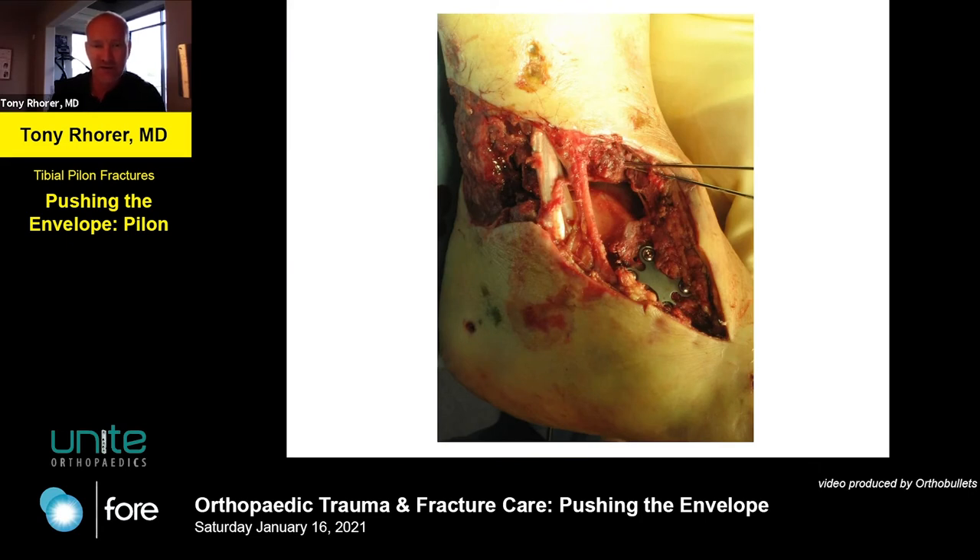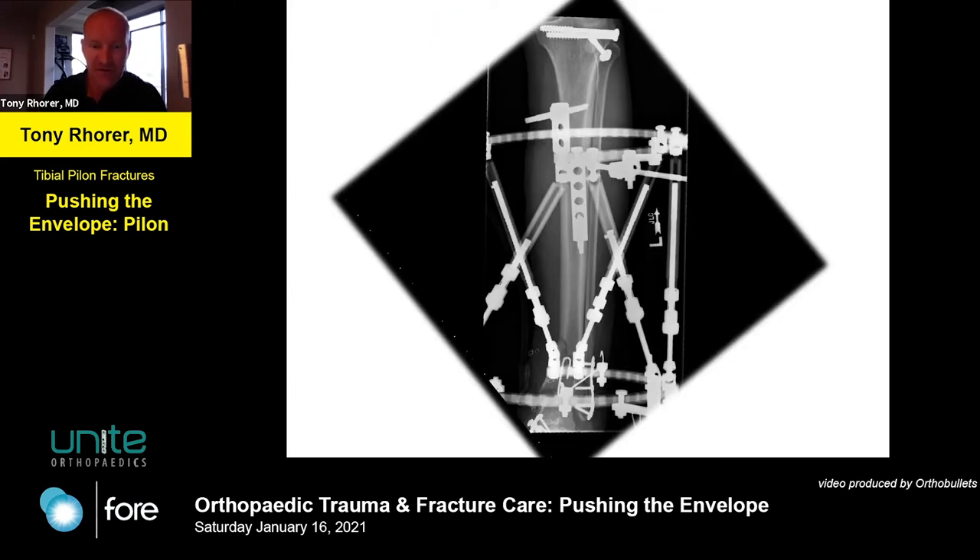I try to be as minimalist as possible. Since this is a pushing-the-envelope course, I'm going to show you something that's a little bit out there - it's probably not for everybody, but for me it works pretty nicely. Here you get an inside look at the joint. Those are the posterior tendons coming down behind the medial malleolus, which is essentially gone. The two K-wires are transfixing the articular surface, and you can see the dome of the talus right there - a nice slice of talar dome.